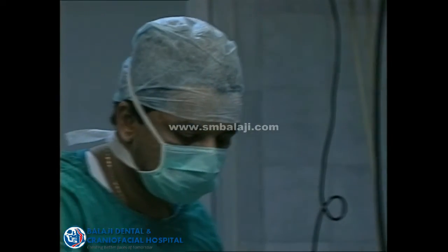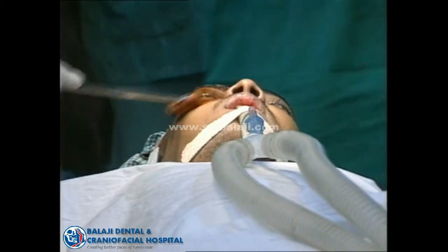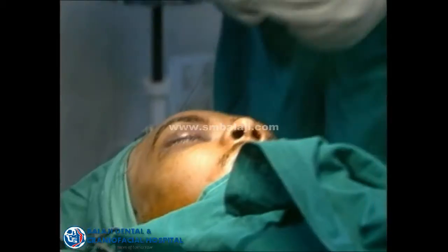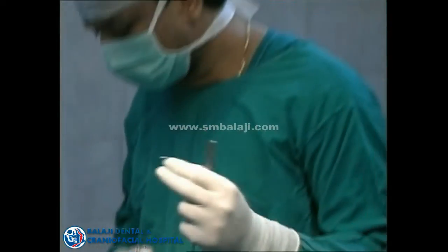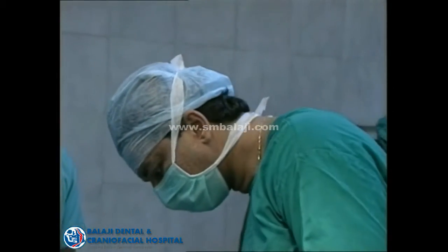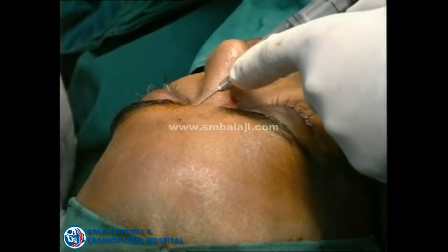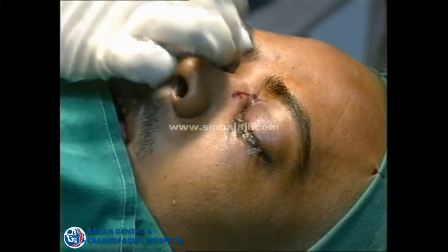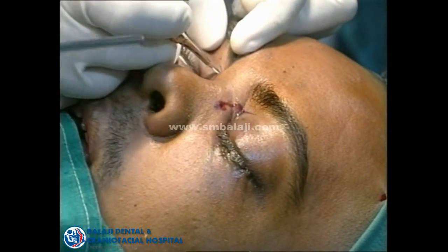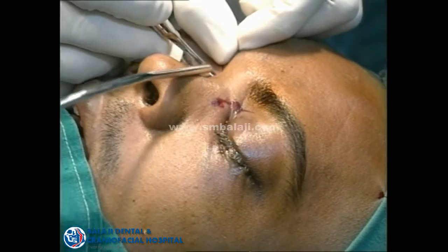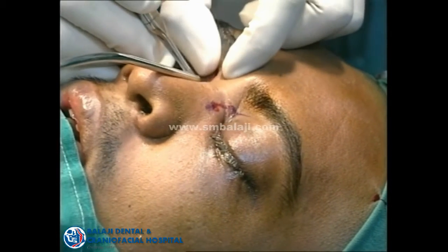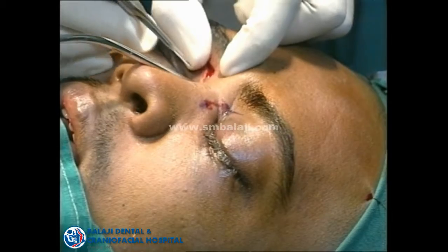The aim of the treatment is to achieve a minimal scar. I have planned for a medial canthal incision. You can see I have marked the incision line, making the incision and approaching the sinus.